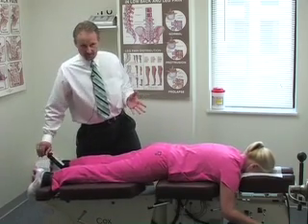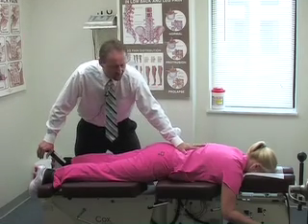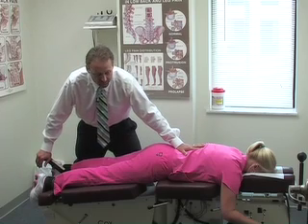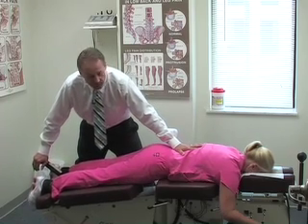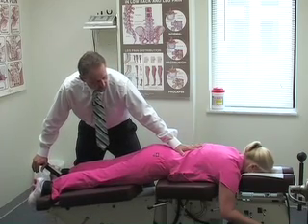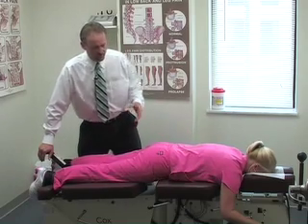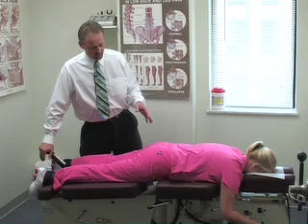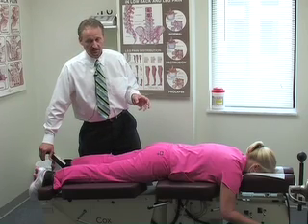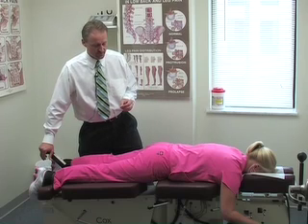This treatment has been extensively researched and has been shown on cadaver studies to actually create a negative pressure in the neighborhood of negative 200 millimeters of mercury inside that disc. So to reduce a disc bulge or a disc herniation, taking the pressure off the nerve. It also has the added benefit of helping stenotic conditions. This treatment has been shown to increase the size of the intervertebral foramen by 30% and the canal by almost the same amount. So it's effective for both of those types of conditions.